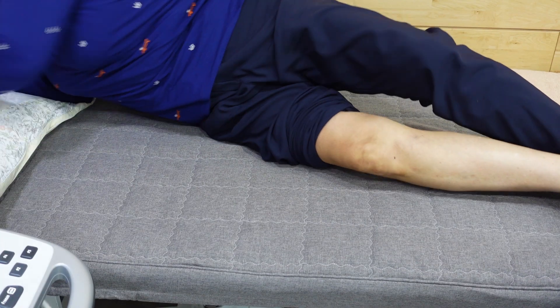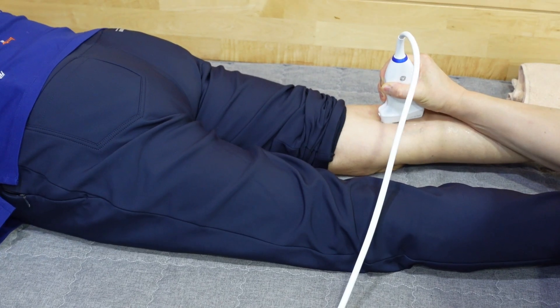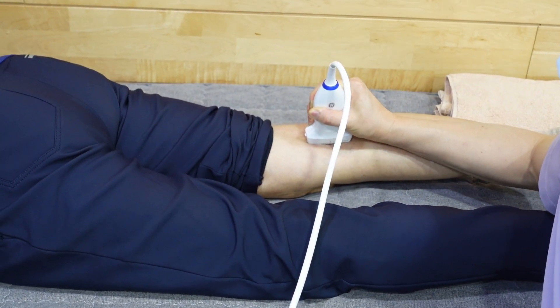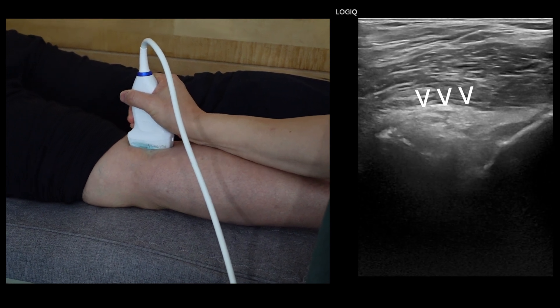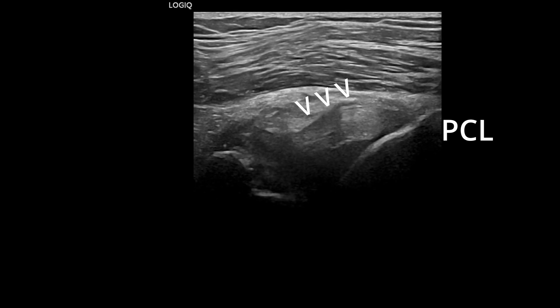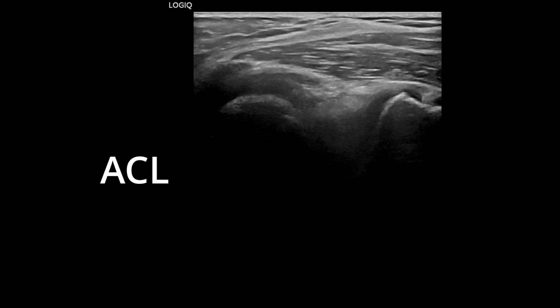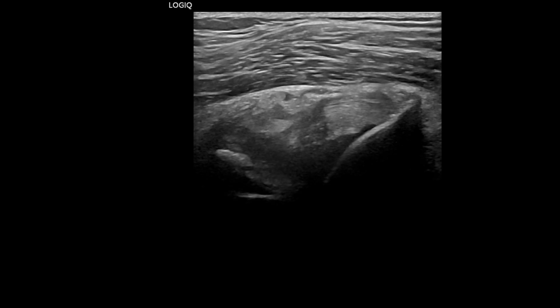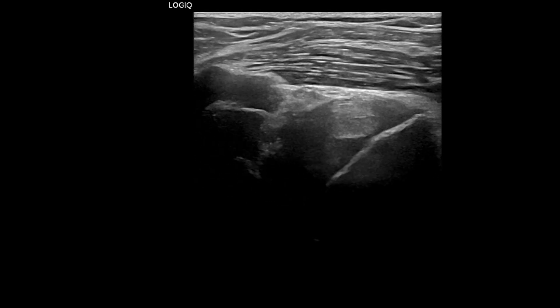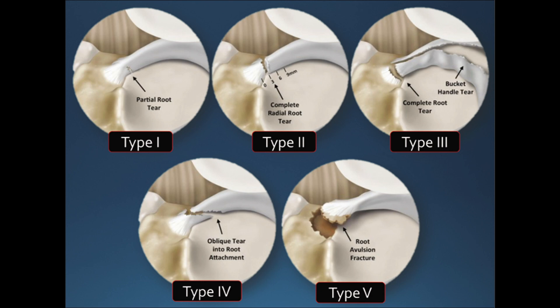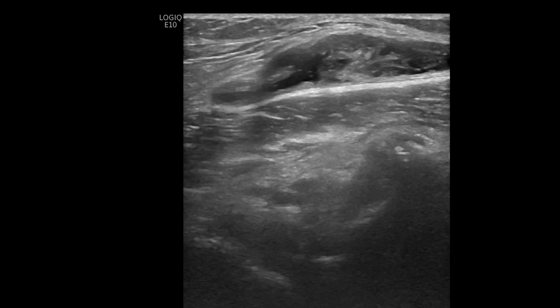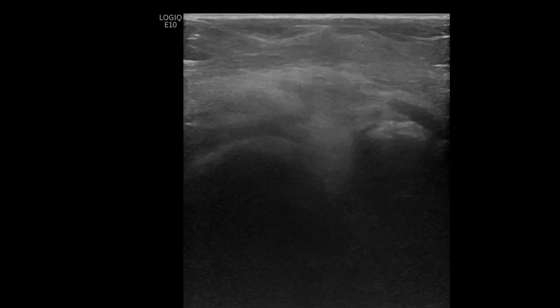Posterior evaluation. The patient should lie prone with an extended knee to evaluate the posterior knee. Begin by locating the echogenic posterior capsule through longitudinal scanning. From there, trace the posterior triangular low echo areas corresponding to the posterior cruciate ligament and the posterior portion of the anterior cruciate ligament. Pathologies of the anterior cruciate ligament are common in adults experiencing knee pain during flexion and extension. Tears at the posterior root of the medial or lateral meniscus are common causes of severe knee pain, particularly during flexion. Unfortunately, ultrasound diagnosis of these root tears is not typically feasible. However, you can suspect such tears if the patient exhibits painful flexion limitation and fluid accumulation in the posterior fat pad.